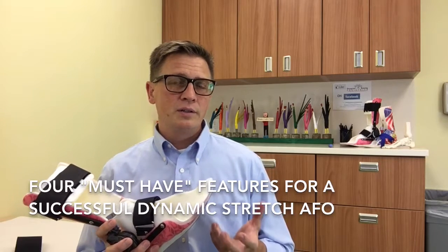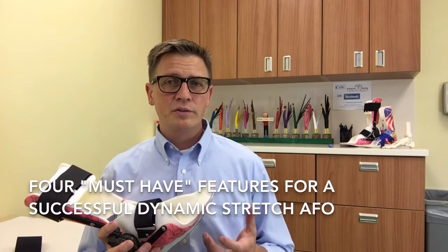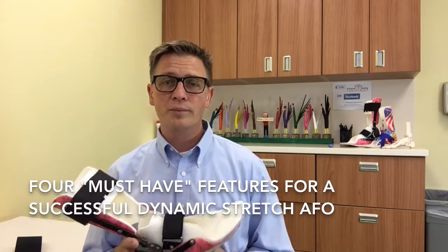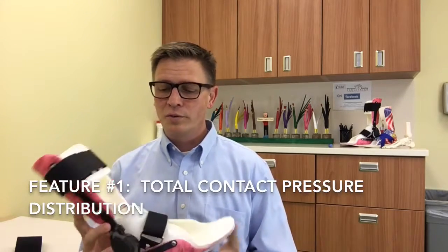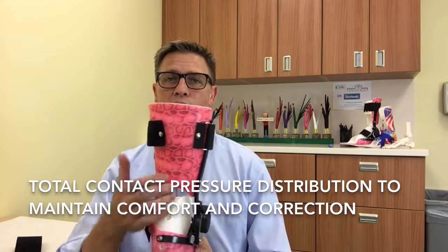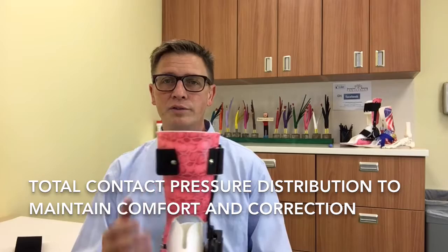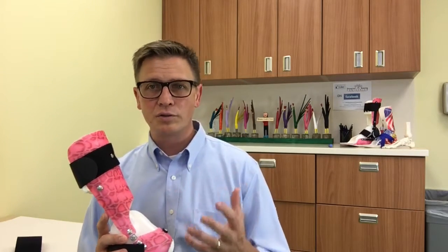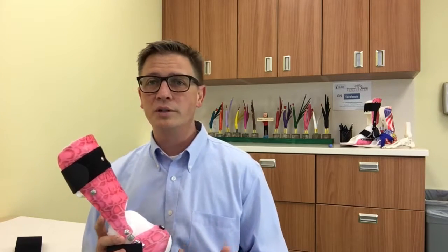In order for any stretching treatment to be effective and successful, there are really four things that are important to make sure are incorporated. The first is we need to make sure that we have total contact correction — correct bony alignment throughout the foot and ankle to protect the midfoot and foot structure, so that the stress created with any sort of stretching does not further compromise foot structure in the patient.